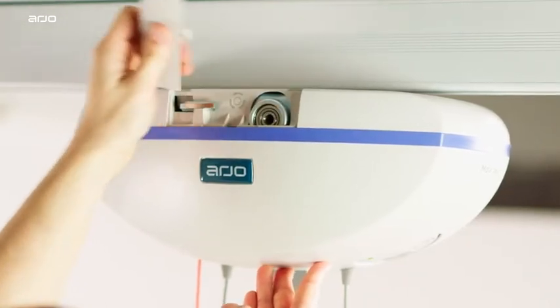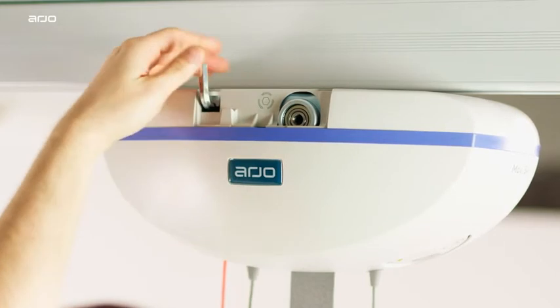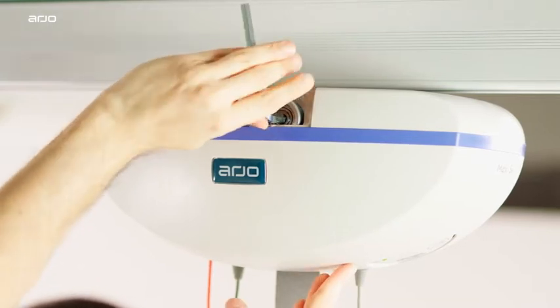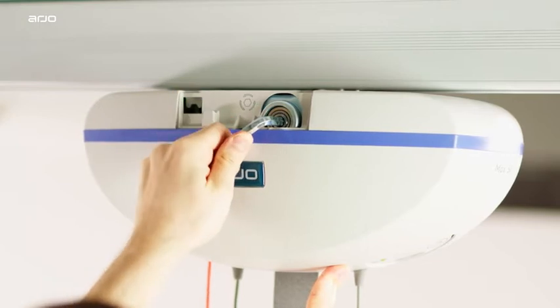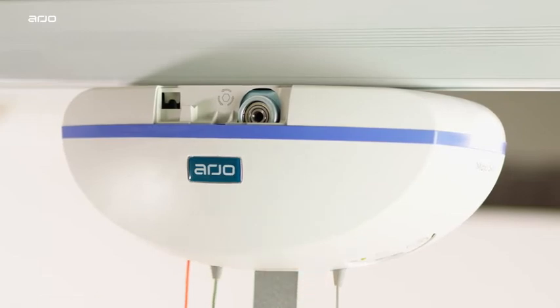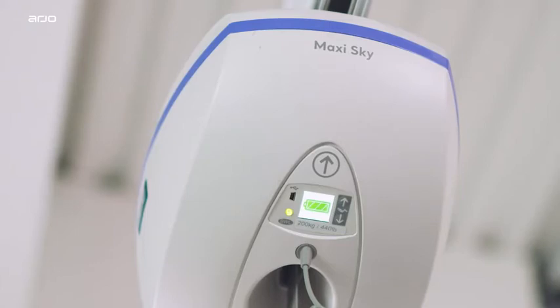Open the small side door to access the lowering mechanism. Pull the 8mm hex key from its storage compartment. Insert the hex key deep into the axle. Turn the hex key counterclockwise to slowly lower the patient. Once the patient is lowered and secured within a chair, bed, or wheelchair, call a qualified technician to inspect the lift.